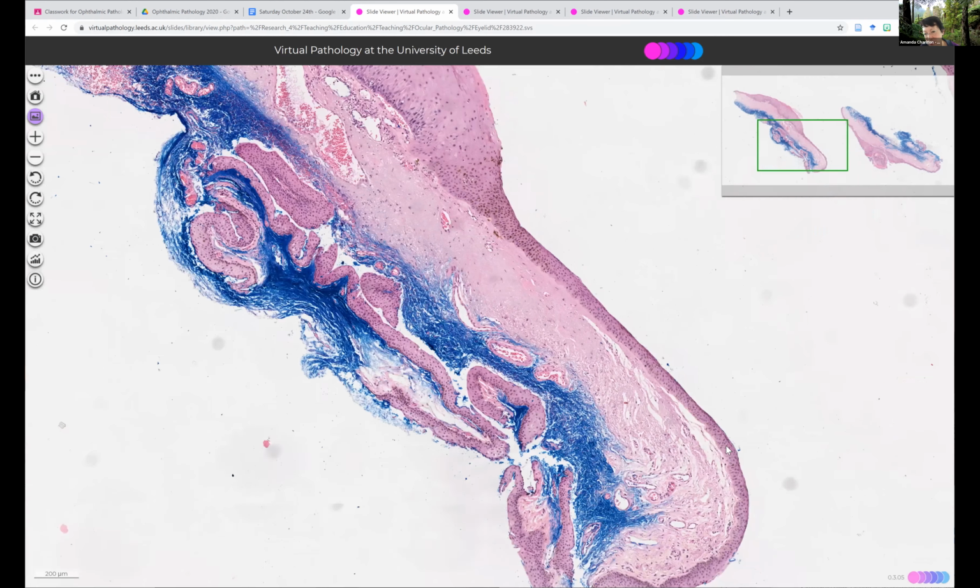Then it comes to the grading features. How do you like to grade them, Diane? So I grade them in terms of how far through the lesion the basal cells are, just like I grade the cervix, and how far up the mitoses go. I actually found this one quite hard to grade. And I got various opinions from the groups I popped into between grade 1 and grade 3. So I just want to reassure everyone that recognizing that this is a conj and a squamous in situ lesion, you would pass this slide, no doubt. And the grade is like the extra bit that we do.